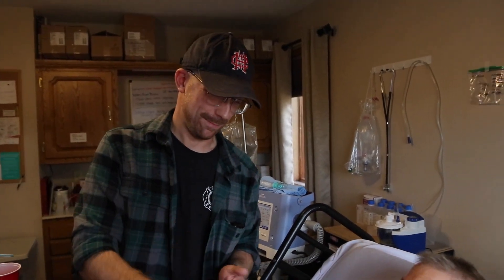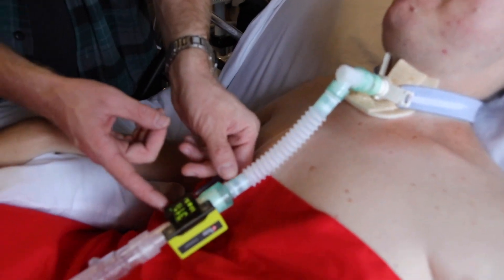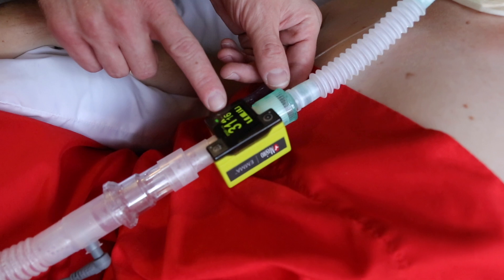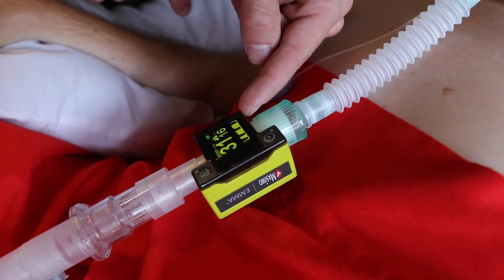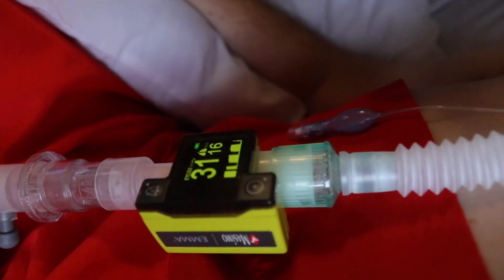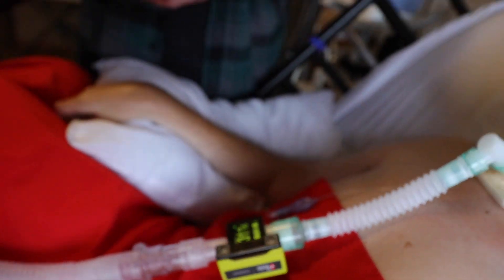We'll come back here with Brock again. He can't talk this time because his balloon on his trach is inflated. But as you can see, the Emma is in line and we're getting a nice solid reading — respirations, the CO2, and the waveform below. The only disadvantage you'll notice is the unit is upside down, but that's not a huge deal.